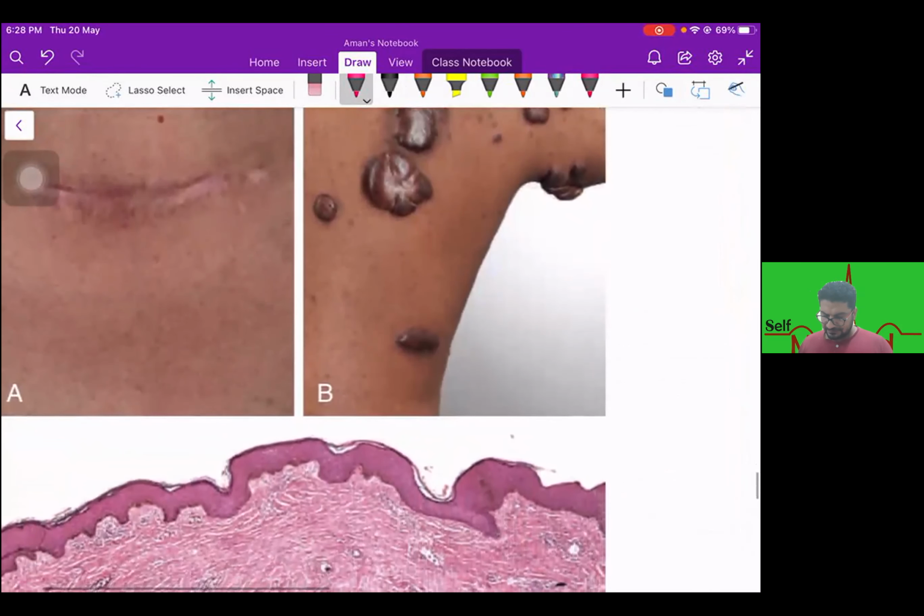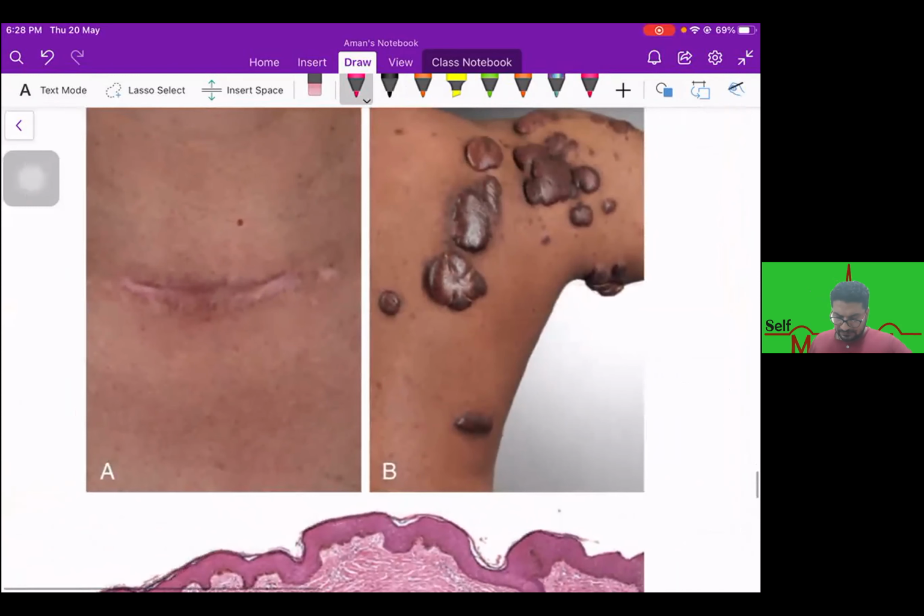Okay, then we have two things. Understand this, this is in front of you. We call this a hypertrophic scar. You can see the regular border and regular margin, so this is called a hypertrophic scar. If I compare this with excessive healing, you can see an irregular border and dense collagen deposition. We call this a keloid.